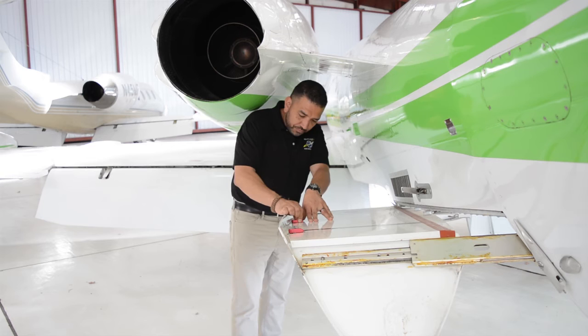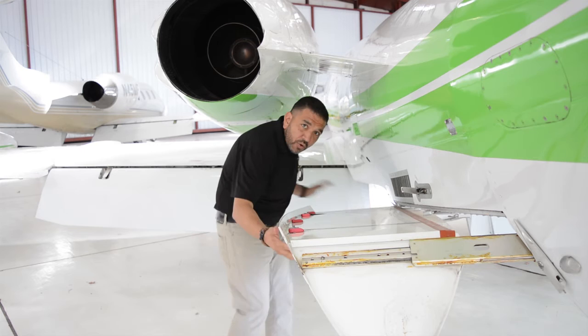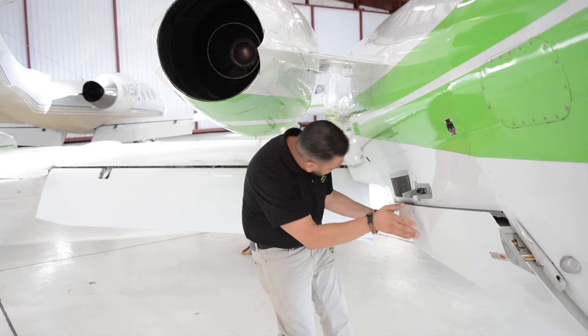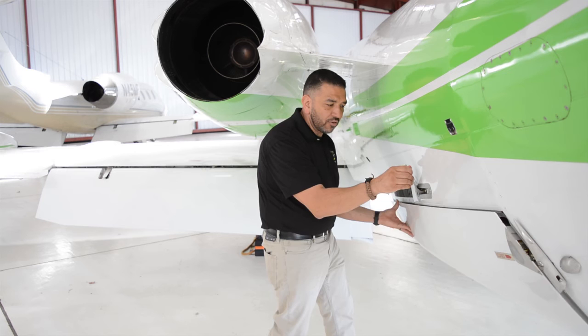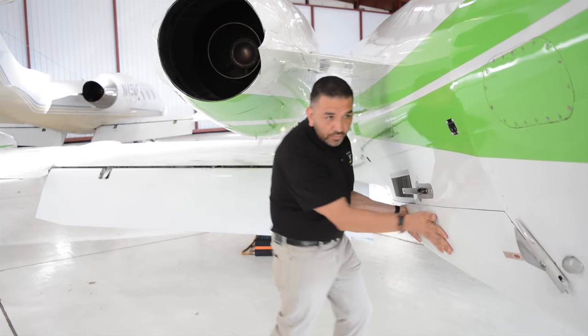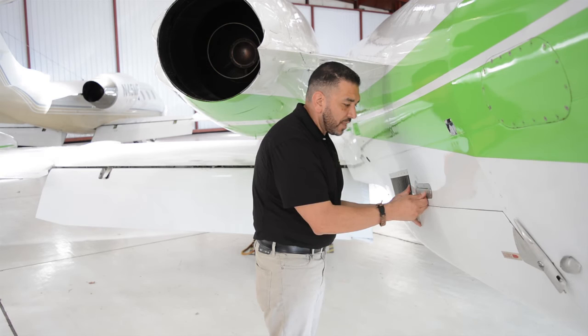Okay, and then I'm going to slide this whole compartment forward, and I want to make sure it clicks into place. As you can see, it gave me a little bit of resistance because this handle wasn't all the way up. So we want to make sure that handle is in. Okay, so now I'm going to bring this into place. That needs to be snapped into place, so that button is actually activated there.